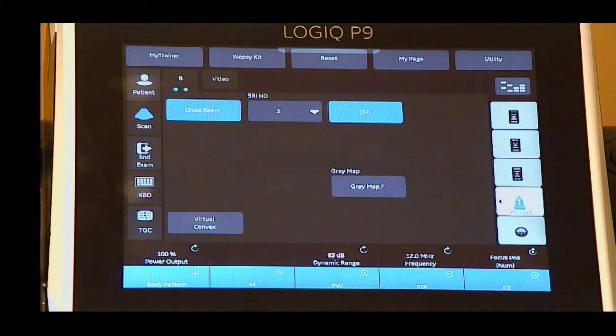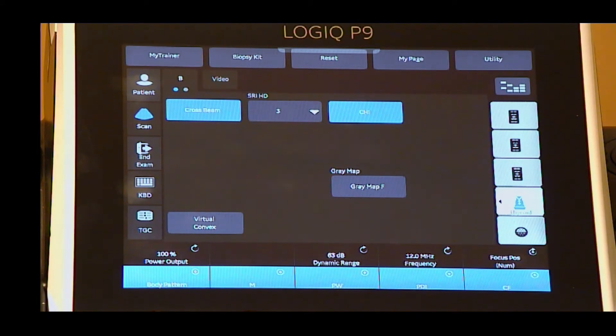Compound imaging combines three or more frames from different steering angles into a single frame. It may help reduce noise in the image and enhance tissue interfaces and border detection.